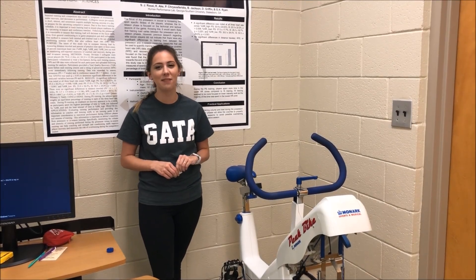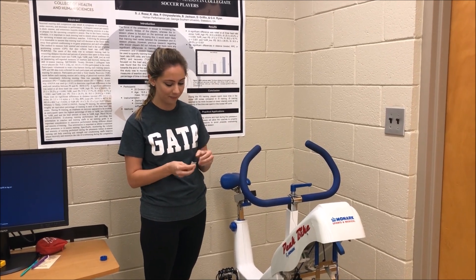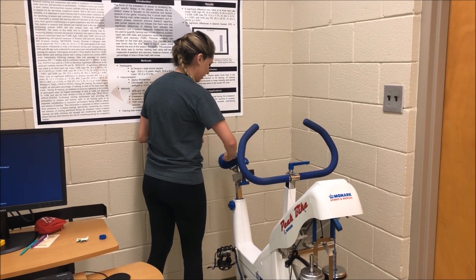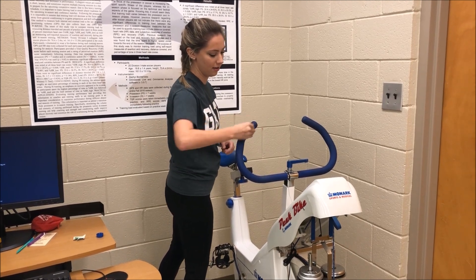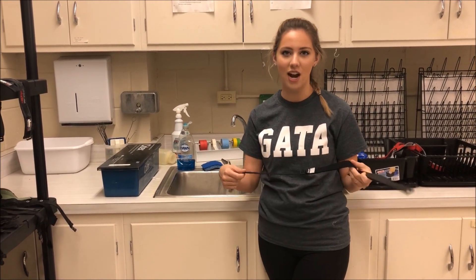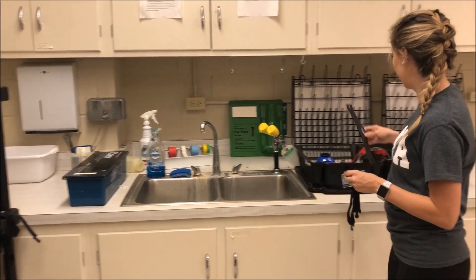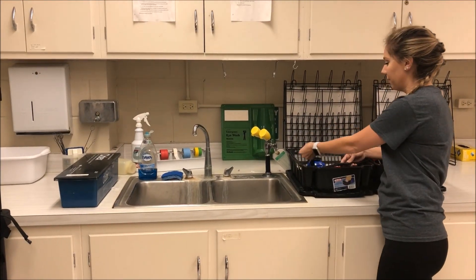Now that the participant has finished testing and we've made sure she is okay, we will clean off the bike using an alcohol prep pad. We will wipe down everything that the participant touched to make sure it's sanitary between subjects — the seat as well as the handlebars. Now that the bike is cleaned off, we also want to clean the heart rate monitor and the strap that the participant was wearing. Both are washed with soap and water using a sponge or brush. Once finished, we want to make sure we hang them up to dry.